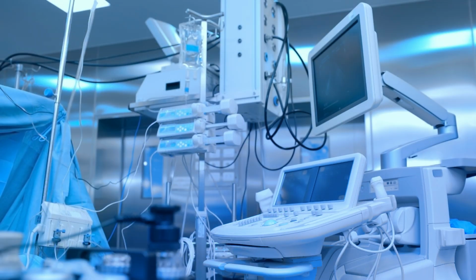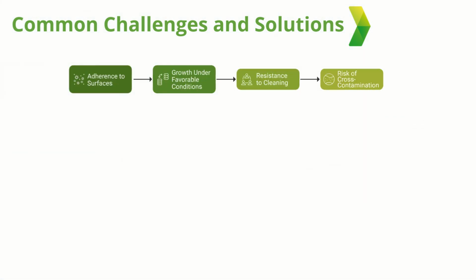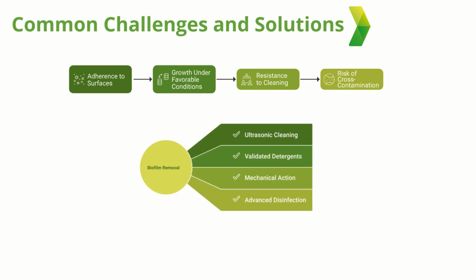Cleaning validation can present challenges, especially with complex devices that have intricate designs. Biofilm formation and protein residues are common issues. Employing advanced cleaning technologies such as ultrasonic cleaners and validated detergents can enhance cleaning efficacy.